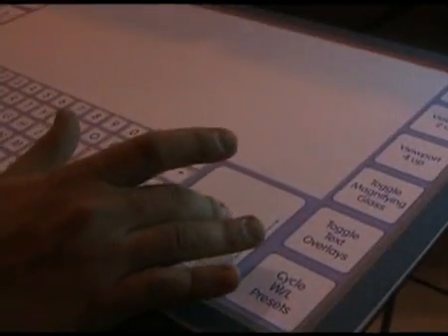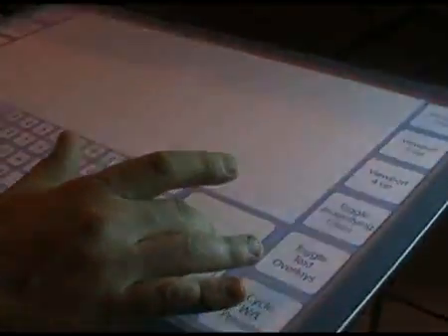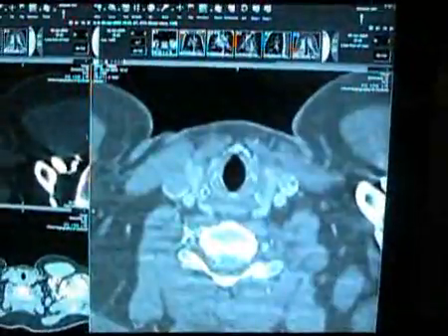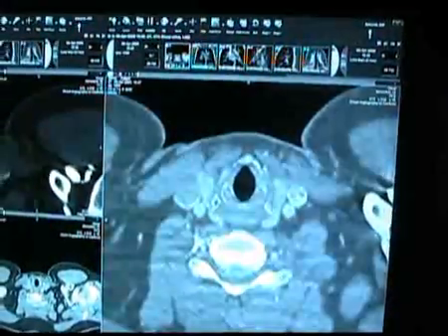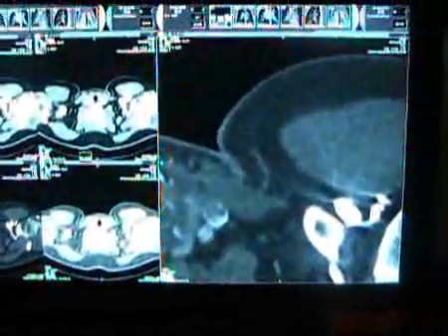What they really want is to work directly with the thin slice data within the PACS idiom, without having to learn a lot of new commands, and in fact having the system do most of the actions for them based on the type of study they're looking at.